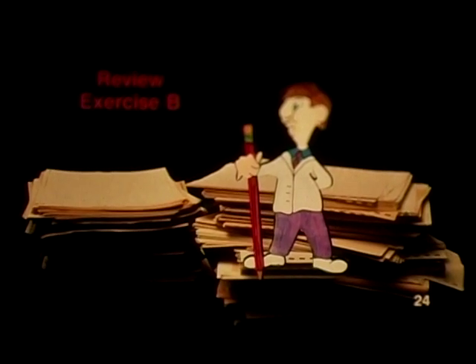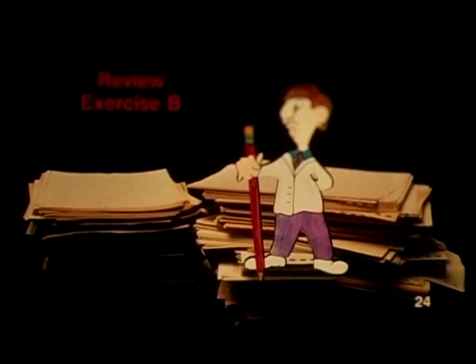Number 24. Maintaining test forms, logbooks, and a quality assurance manual may seem to be an abundance of paperwork. It should be emphasized that this paperwork is not an end in itself, but is used to ensure that the equipment is being monitored and that the participants in the program have a clear sense of what needs to be accomplished. You should now be ready for Review Exercise B in your student workbook.